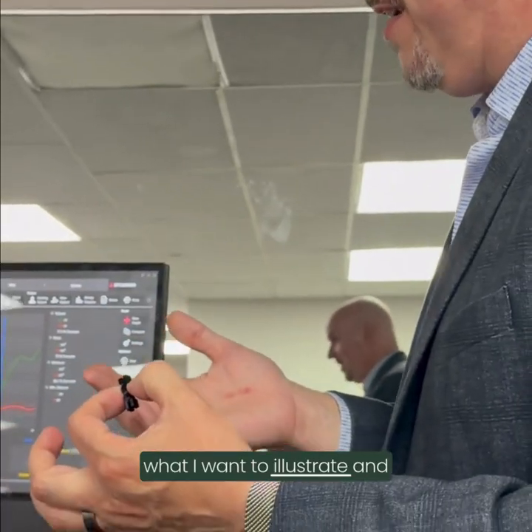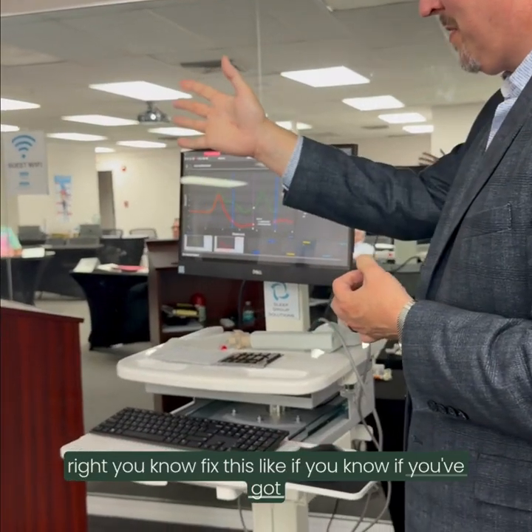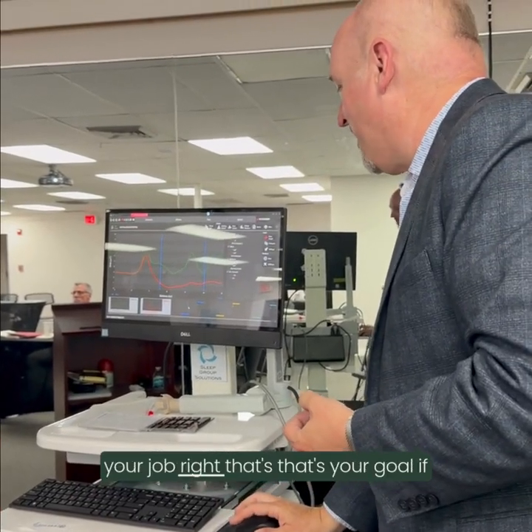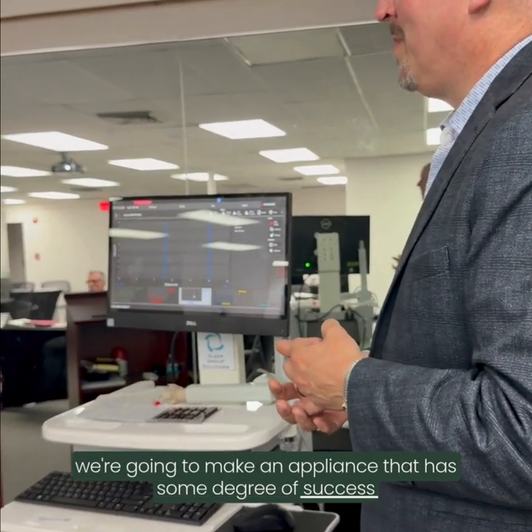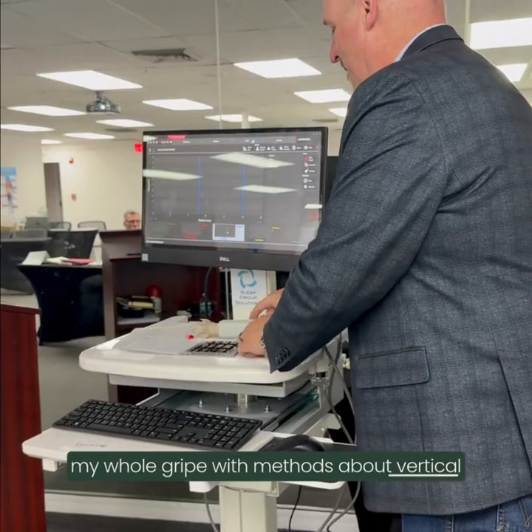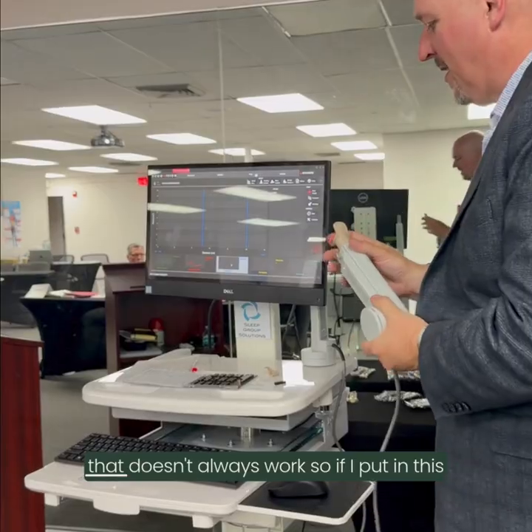But what I want to illustrate, and I think this makes a really good point, is: all right, fix this. If you've got a patient sitting here and we're trying to solve this problem of their tremendous amount of collapse, that's your job, right? That's your goal. If we're going to make an appliance that has some degree of success, we should be able to make that airway meaningfully less collapsible. And my whole gripe with methods that say vertical doesn't matter and all you have to do is crank them forward and titrate them and advance them is that it doesn't always work.